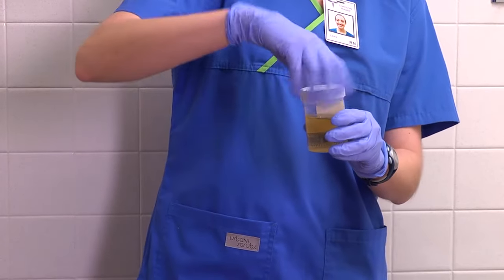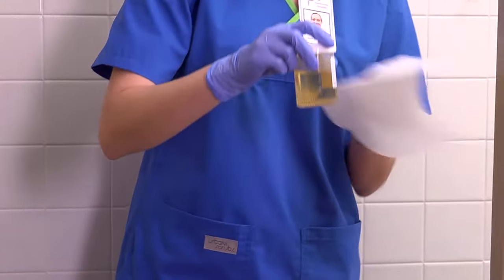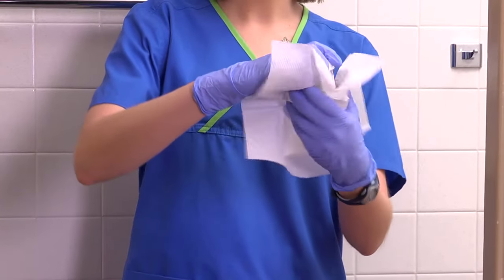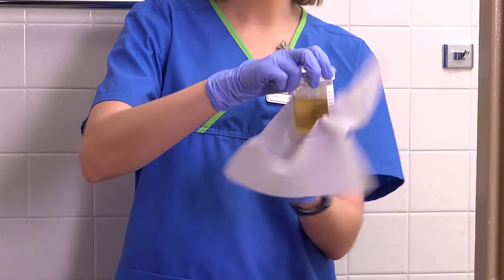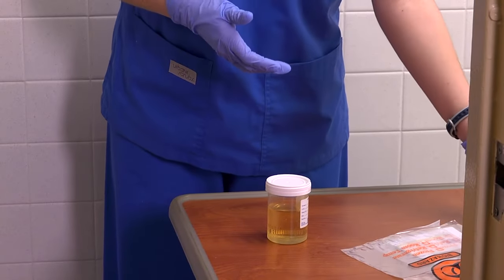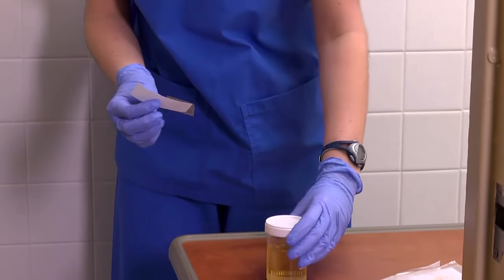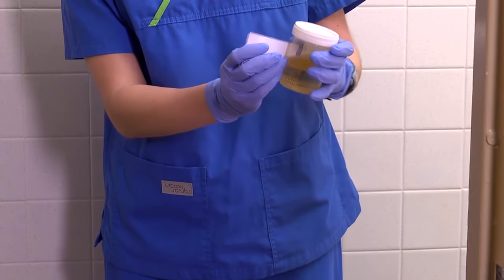Replace the cap securely on the specimen container, touching only the outside of the cap. Inspect the specimen for contamination with toilet paper or stool and wipe any droplets of urine off the container. Be sure to label the container, not the lid. If the patient is a woman, indicate whether she's menstruating.